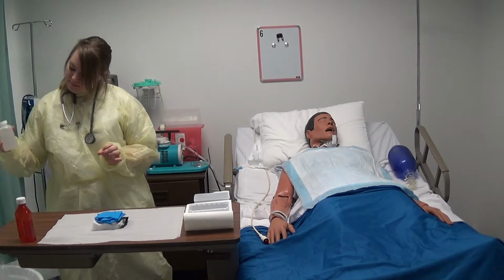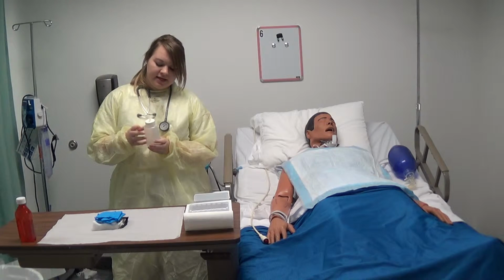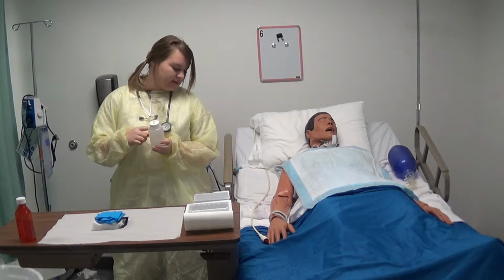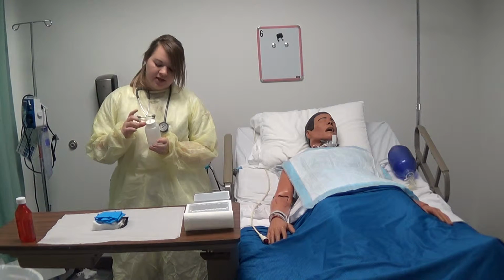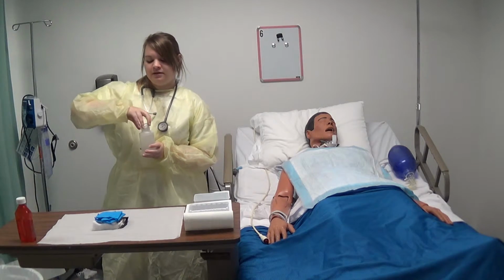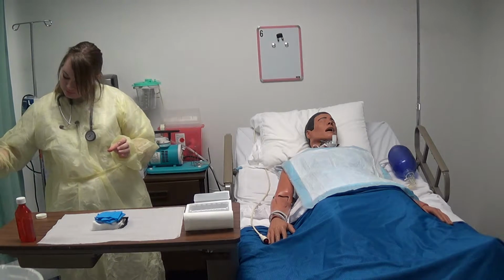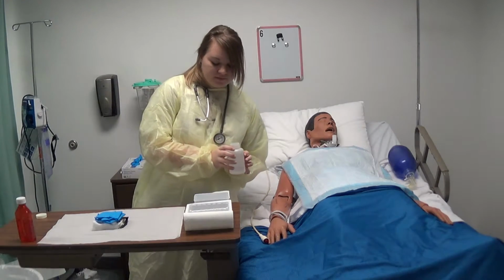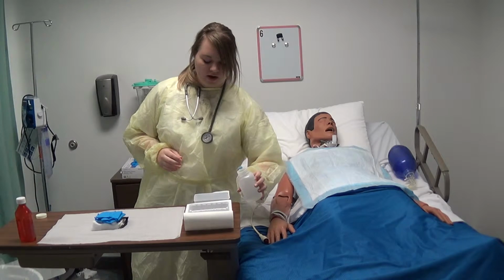I have a bottle of normal saline that I used for an earlier procedure on this patient. It already has the time that it was opened, my initials, and his patient information. It is less than 24 hours old, so I can use it. However, I must lip it before I use it. So I would lip it, and I'm going to pour some saline in each of the 3 parts.